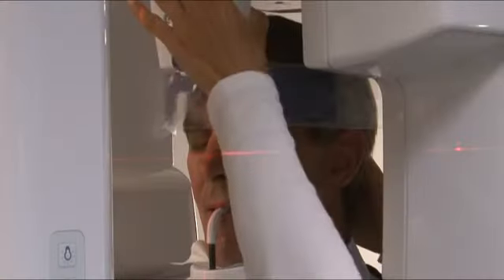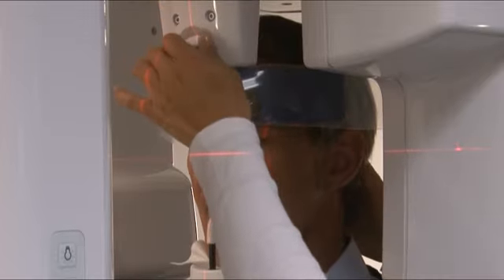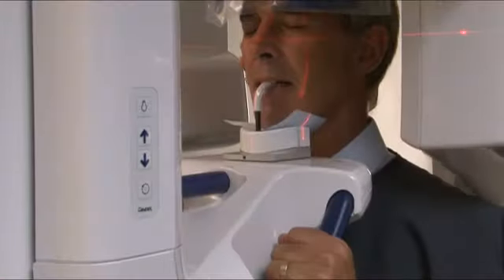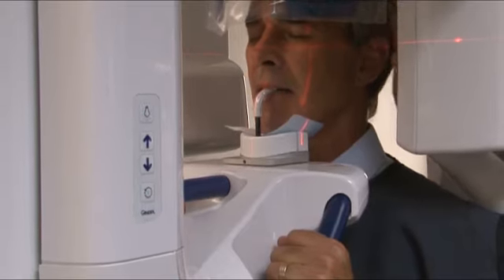Carefully push the head support towards the patient. Rotate the head support knob clockwise to close temple supports so that they gently but firmly grip the patient's head. Ask the patient to maintain a firm grip on the hand grips. Place your hand on the back of the patient's head to support head position.